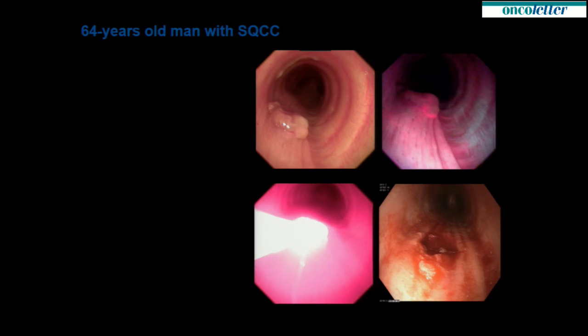This was one of these patients with a squamous cell carcinoma who did refuse systemic therapy. He had different mucosal metastasis of his cancer, and then after injection of the photophrin, here this was the autofluorescence bronchoscopy, then thereafter this was the illumination with a special kind of laser, and one day later the tumor had disappeared. He had quite many of these tumors, so this intervention was taking more than 2 hours.